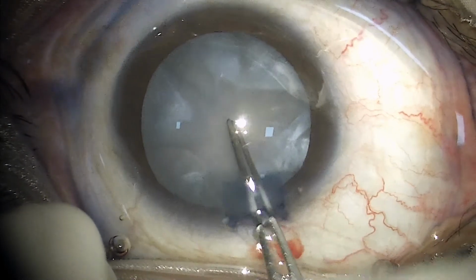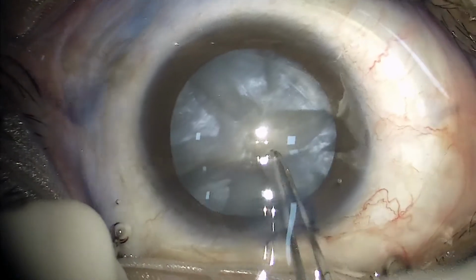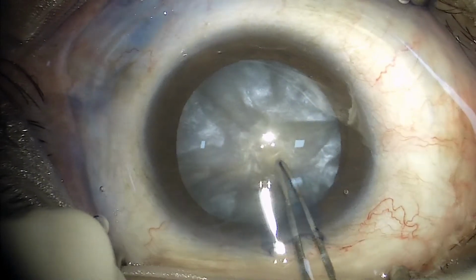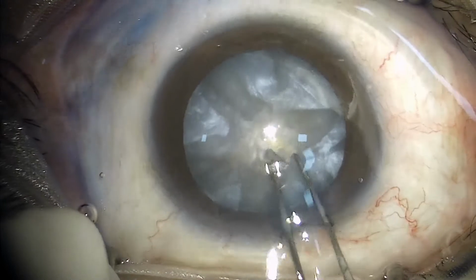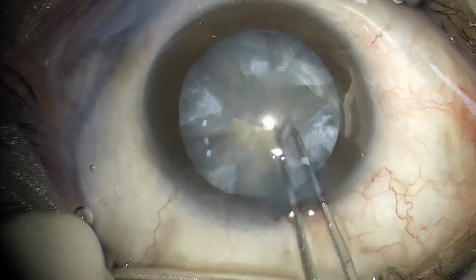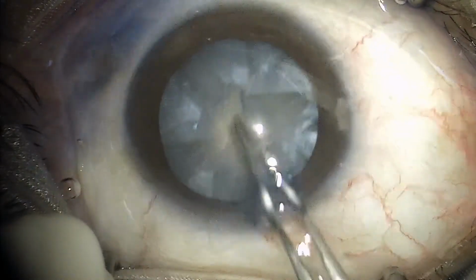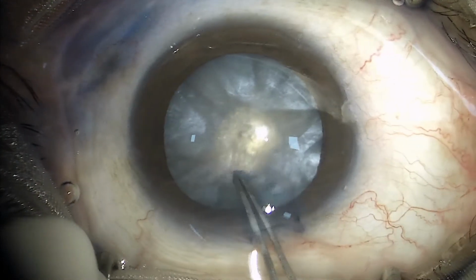A smaller rhexis should be attempted just to have some time to decompress the increased intralenticular pressure. Here we can see that just nicking the capsule releases some amount of fluid, although the stained capsule and a small nick in the capsule didn't allow any progression of the initial cut. So here I am making a very small rhexis just to allow the burping of the retained fluid and pressure.